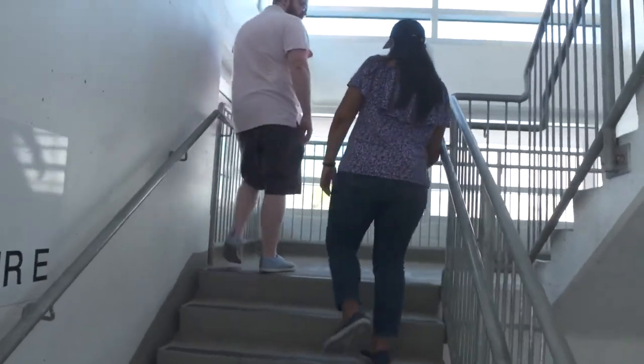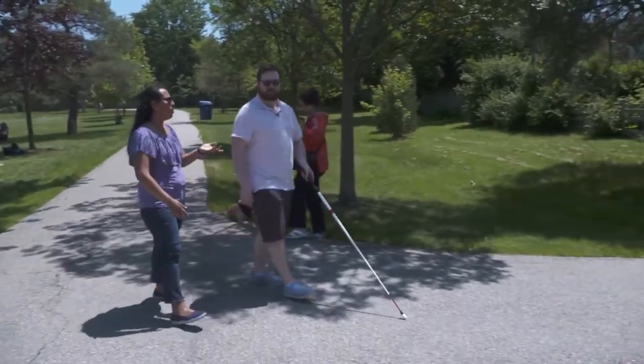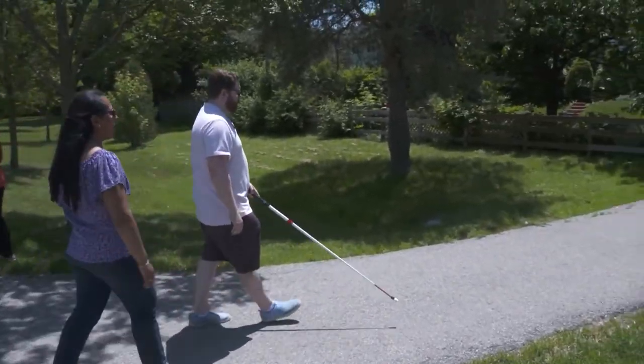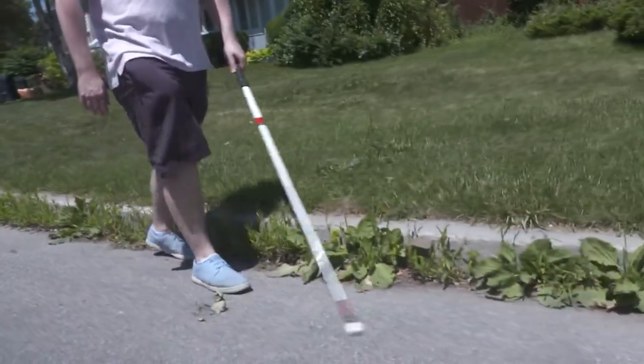Descending the stairs was the same process — extending the cane to find the step before proceeding, and repeating until reaching the bottom. Alex thoroughly enjoyed the lesson with Anita, learned a ton, and now feels more confident using the cane to get around both indoors and outdoors.